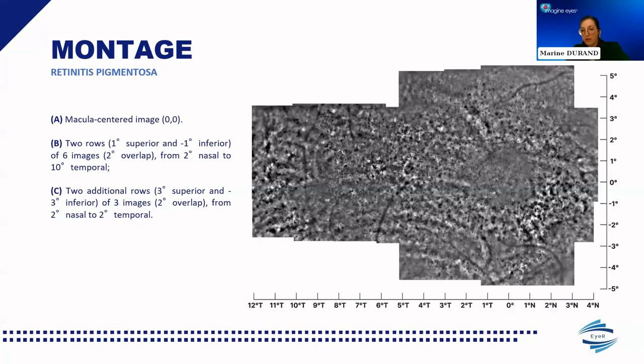So we can see from the montage that you are showing right now that this protocol of acquisition that you have developed seems really to enable picking up interesting features from the retina in RP patients. So how does the new fast protocol workflow, as we call it, that I introduced earlier, help you in the project?